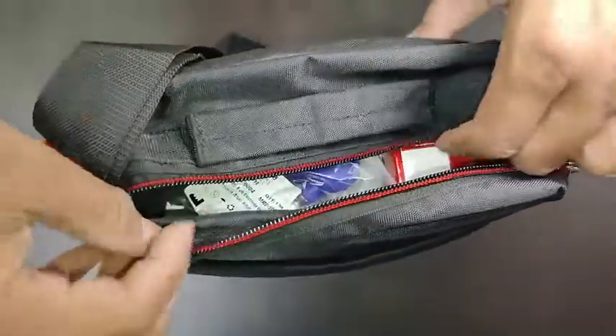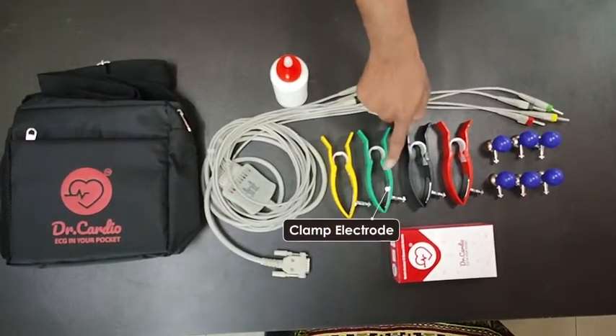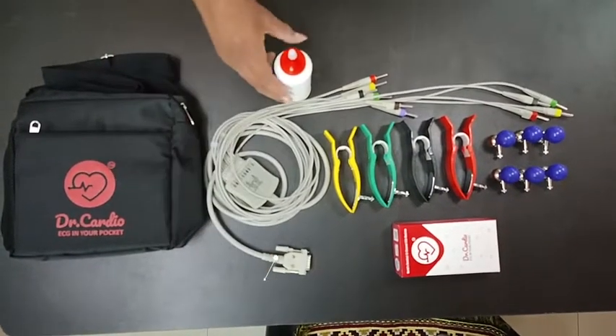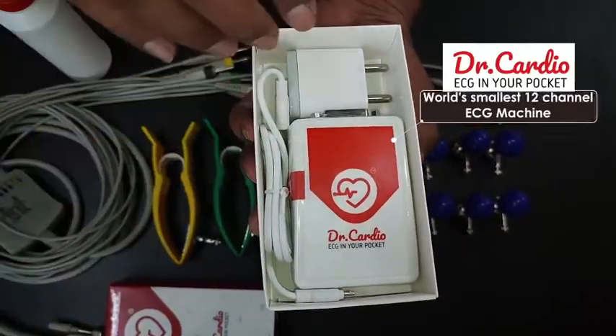When you purchase a Dr.Cardio 12 channel ECG machine, you receive the 12-lead portable Bluetooth ECG machine from Dr.Cardio, a 10-lead standard ECG cable set, 6 ECG chest electrodes, 4 limb clamps, a charging cable, a charger, and a user manual.